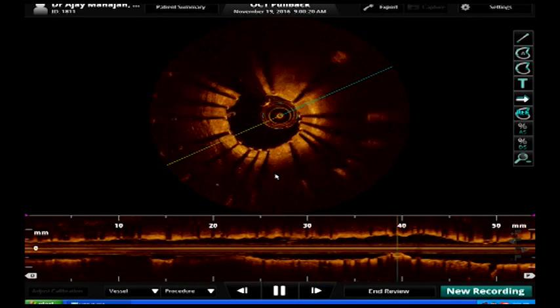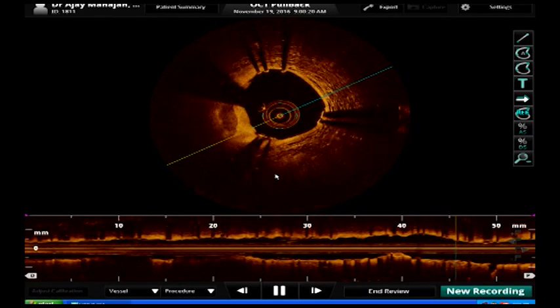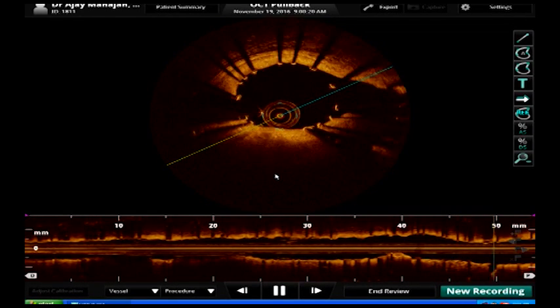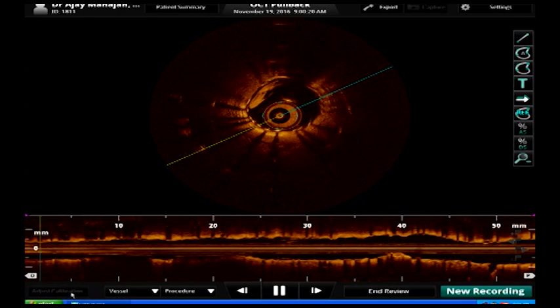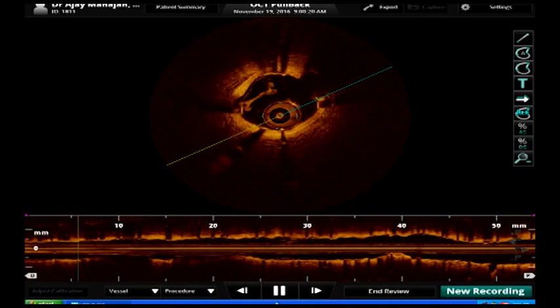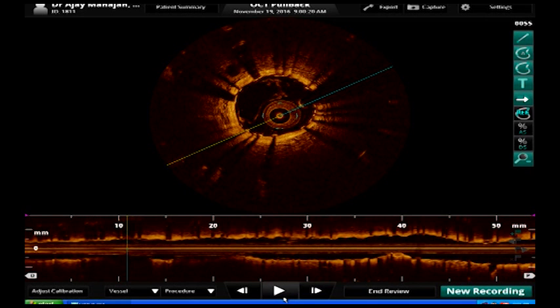Give the 2.75. 2.75 balloon. This is a 3.0 stent proximally and a 2.5 distally. Yes. I think a 3.0 proximally can be taken up to 3.5 with post-dilatation if need be. And as we see here in the proximal at the 40th mark, the stent is not well deployed, so obviously he's choosing to post-dilate over there.